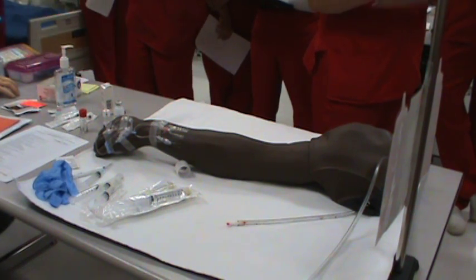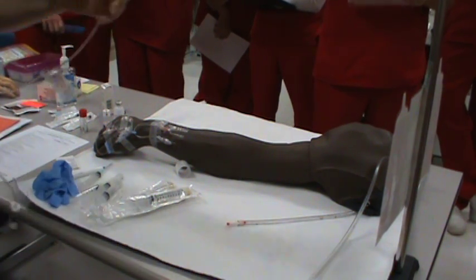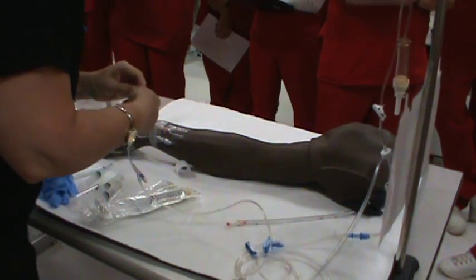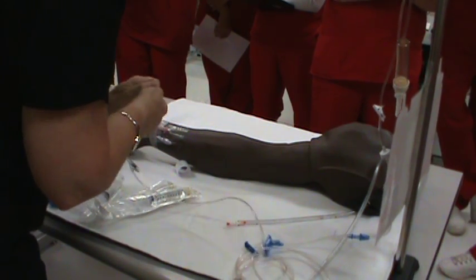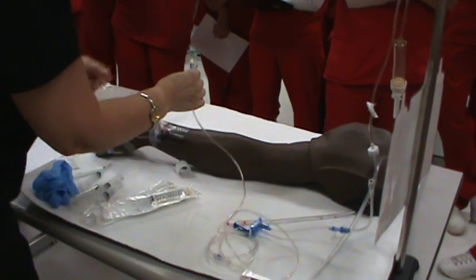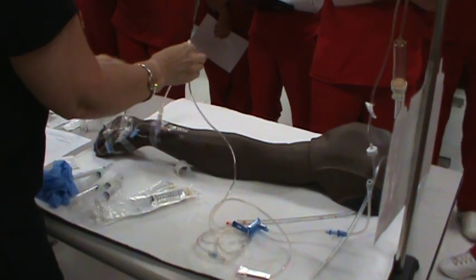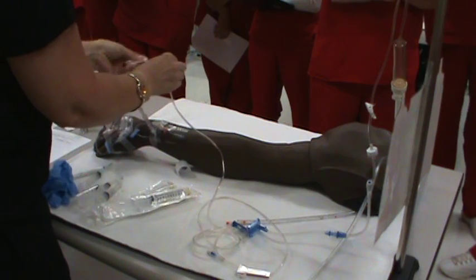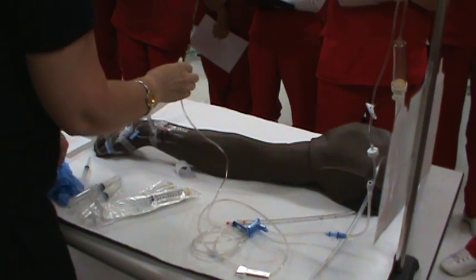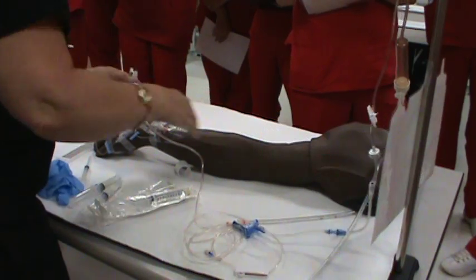So this is hooked up to your fluids, and this is in your patient. So in this case, when they say occlude, close this, so everything's running, and you just bend it, that's occluding it. And you scrub your hub. Did you stop the pump though? Yes, you can pause it. It'd beep like crazy, let you know.